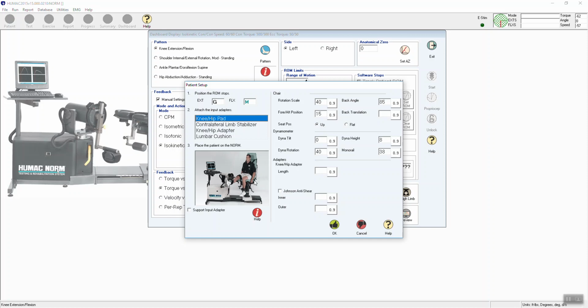And then once the person is positioned, and this is at 40 and that's at 40 and a height of 8, you step on the pedal, you open the Y translation, and you slide that patient forward to align the joint with the axis of rotation of the dynamometer.